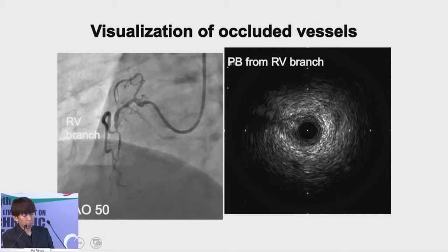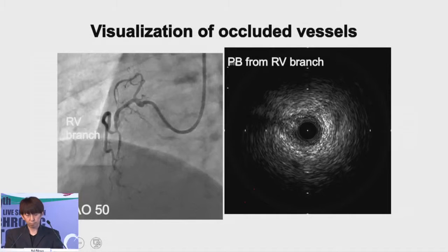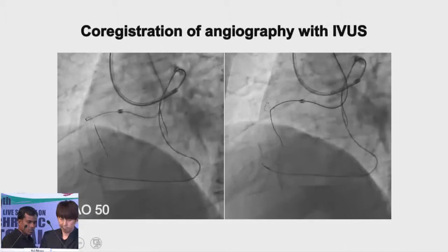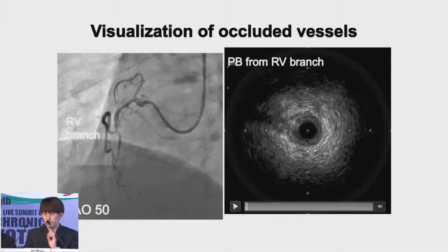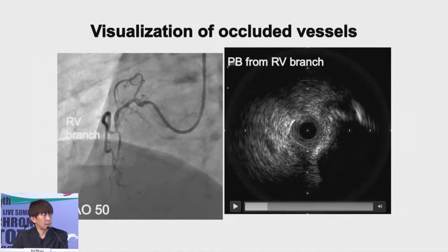IVUS cannot move. In the right panel, IVUS clearly shows the occluded vessel from 4 o'clock.